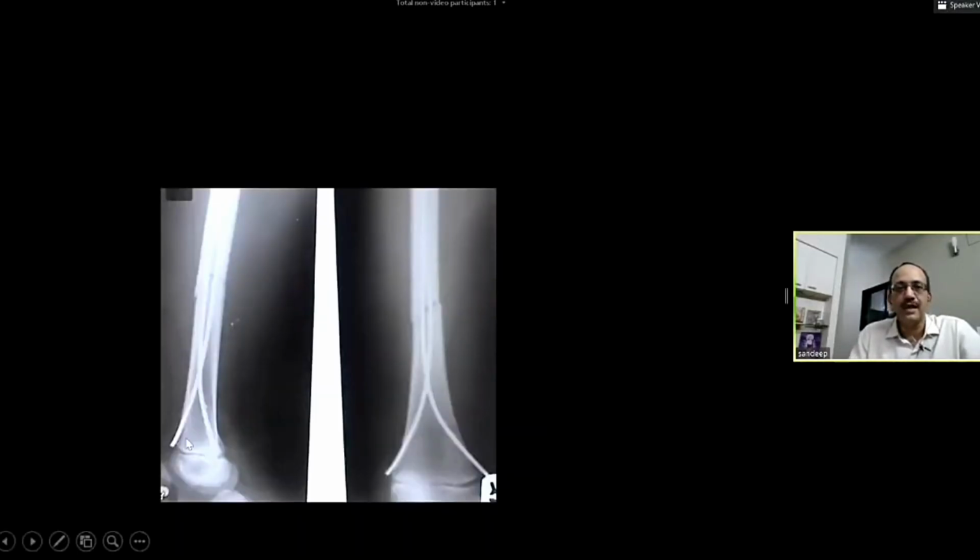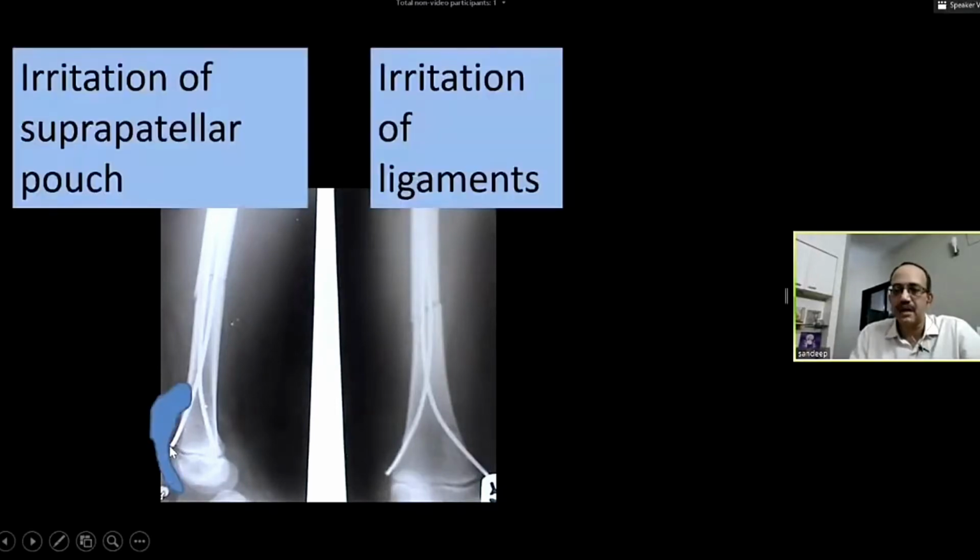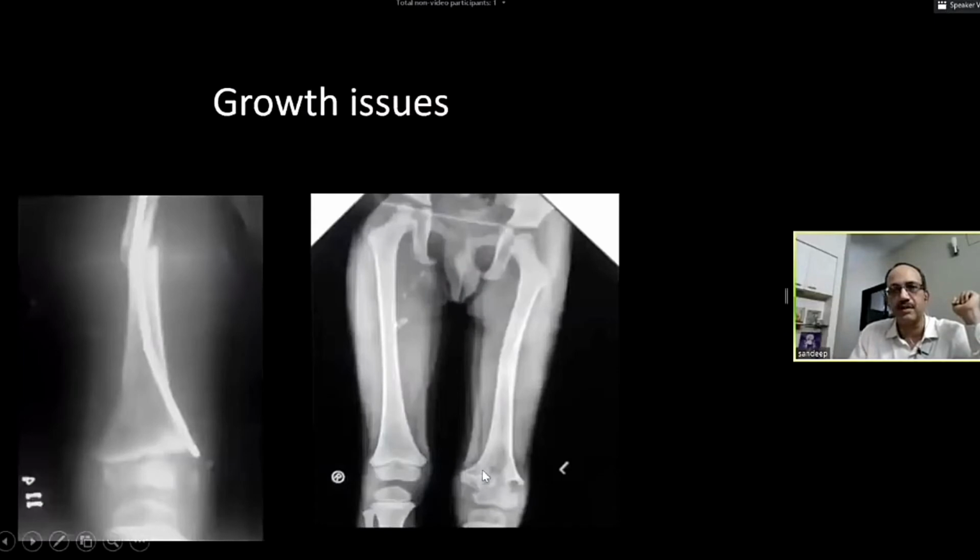Now, if you don't do that, if the entry point is not right, you can end up having a nail which rotates or is placed too anterior, and that irritates the synovial pouch. So irritation of the suprapatellar pouch, nail which backs out, if it is not adequate, may cause irritation of ligament. Finally, the nail should be sufficiently away from the growth plate.